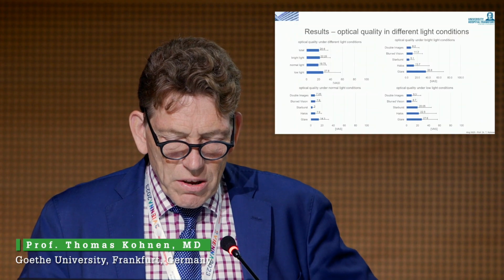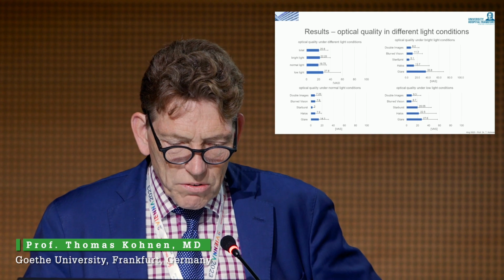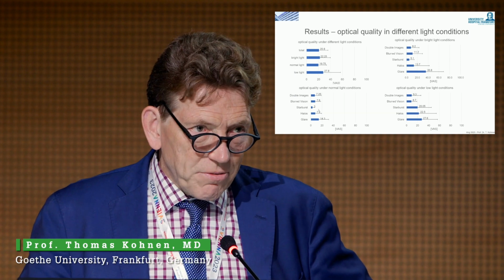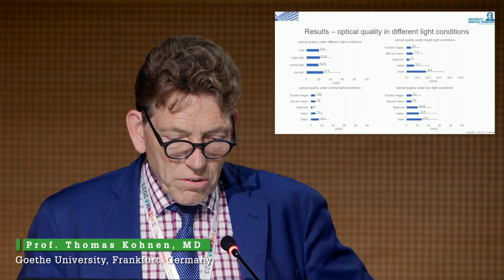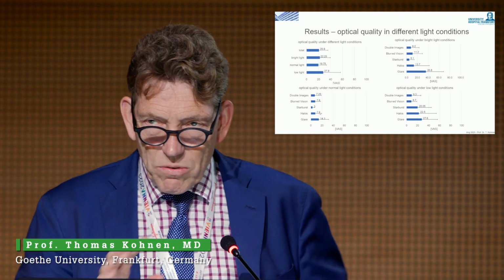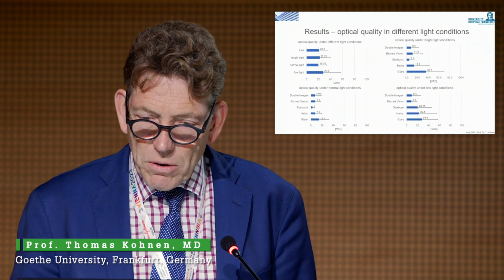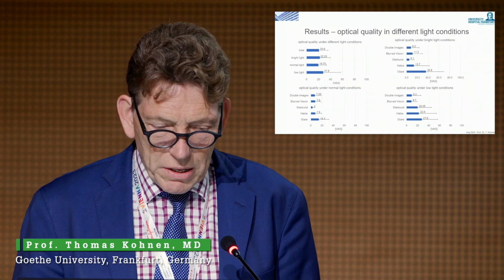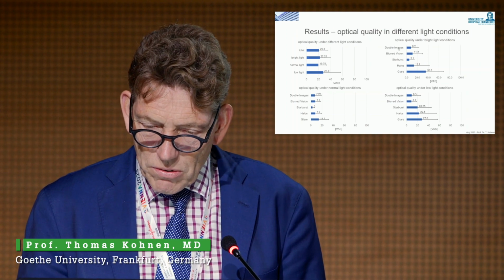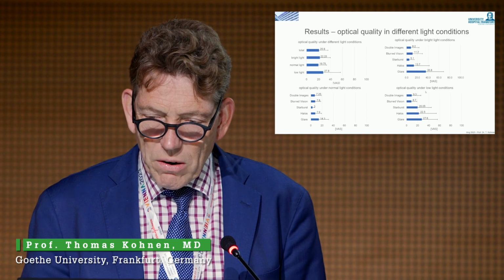And you can see the outcome for double images, blurred vision, starburst, and halos and glare, very low. Because halos is something I find in diffractive lenses to be pretty high. And this is not the case. So 7.9% is a very low number. In comparison, that's in the range of what I see with my non-diffractive EDOF lenses, maybe even a little bit better. If you look here, optical quality, looking at these images at different diopter positions. You can see they put this on the slide, and again here you have this at the various time points. They put this together on this slide.